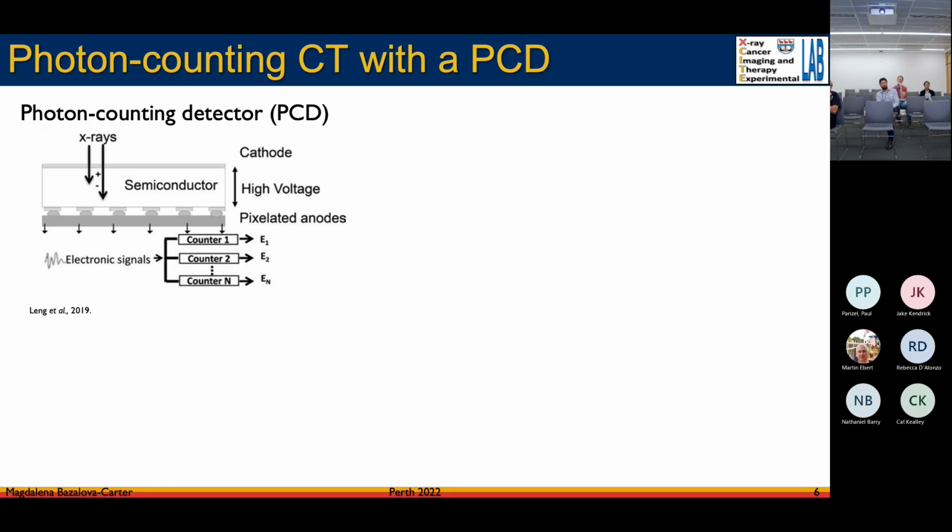But of course, if you're processing the data into more channels, it's just going to take longer. And that's basically been the main drawback of photon counting detectors: they cannot accept such high count rates as we are using in clinical CT scanning.